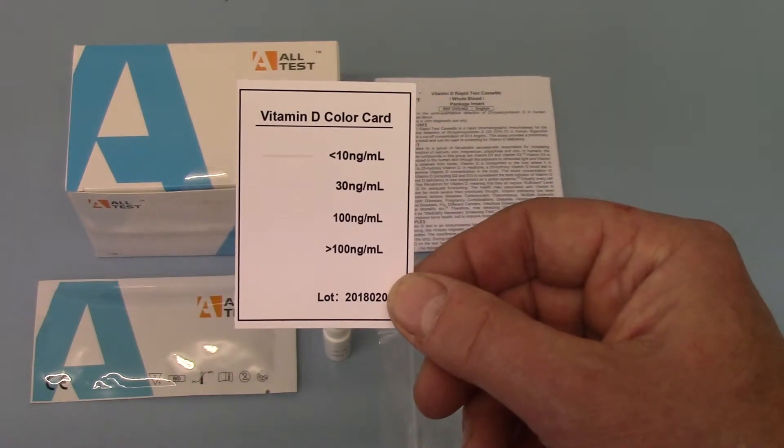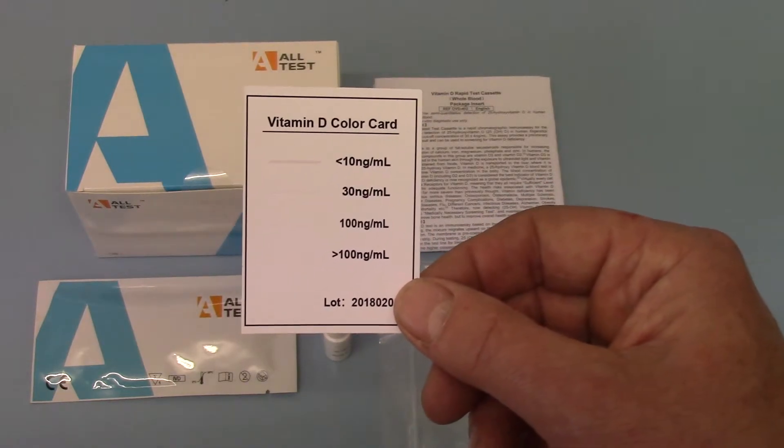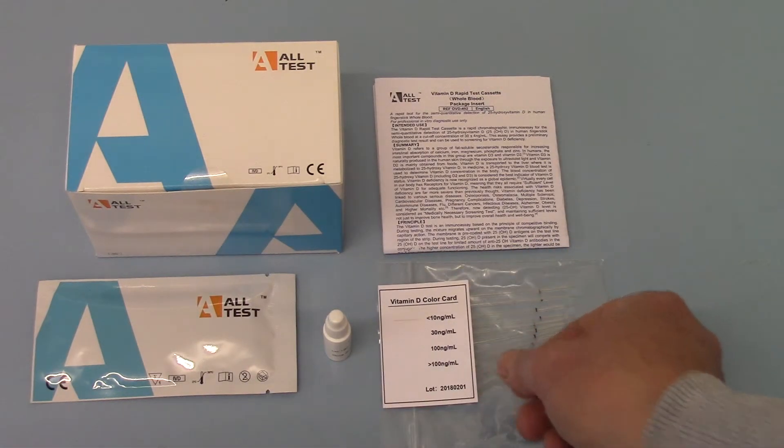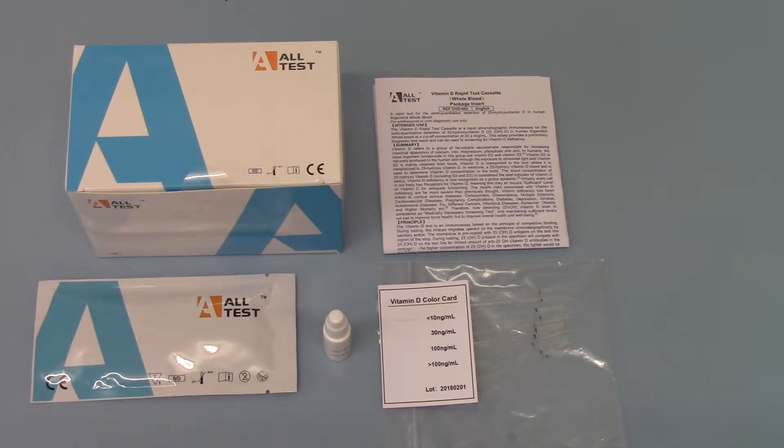The lower the level, the thicker and darker the test line is going to be. This allows instant near-patient estimation of a Vitamin D level in whole blood, serum or plasma to be performed in under 10 minutes, avoiding having to send samples off and wait for lab results. It allows instant elimination of Vitamin D as a reason for a patient's presentation. Available in packs of 10 from the FamilyMed website.